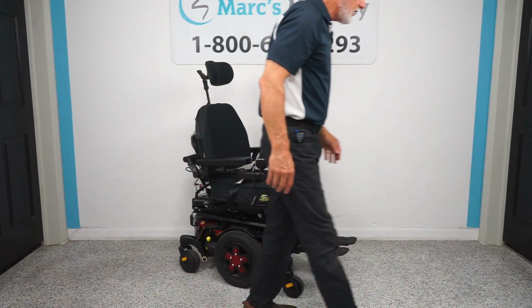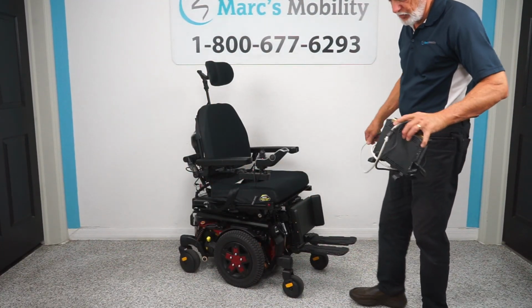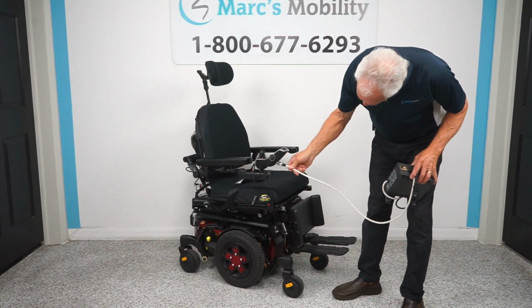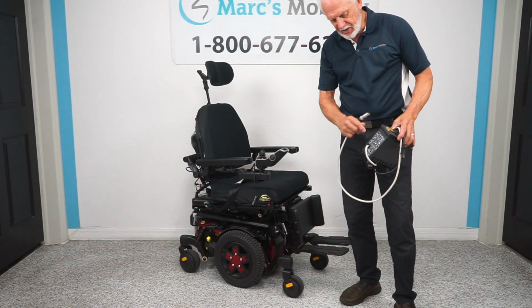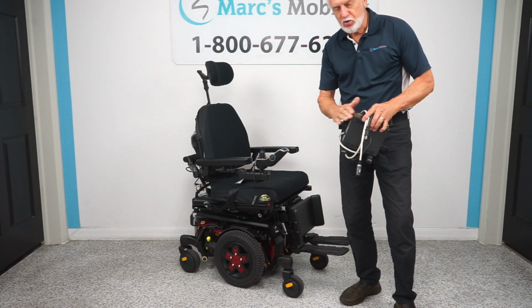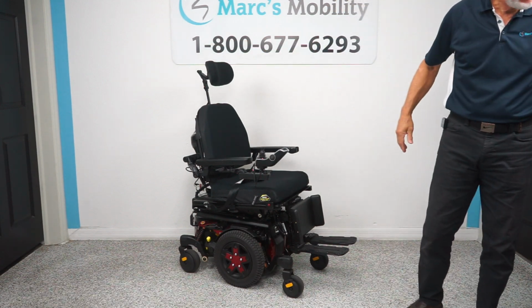When you charge the batteries in this chair, you'll take the charger that comes with your chair. This is not the charger, but we'll use this one for example. You will get a charger and you plug that right there, and as soon as the light goes from orange to green or full, the charger will recognize when the batteries are full and stop charging, okay?